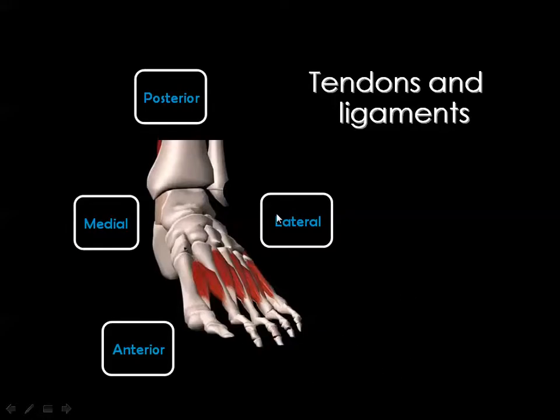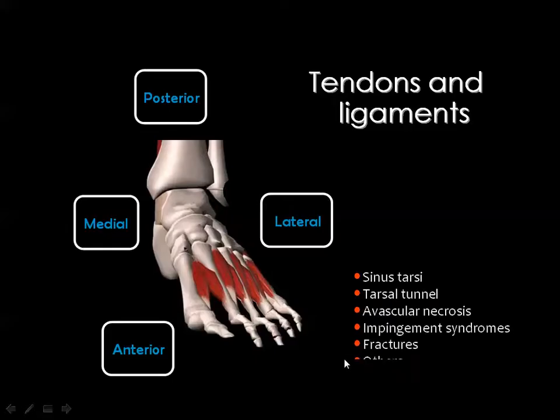Starting by the posterior aspect of the ankle. These are some of the few points that I will handle after finishing the issues of the tendons and the ligaments in every compartment as I mentioned.